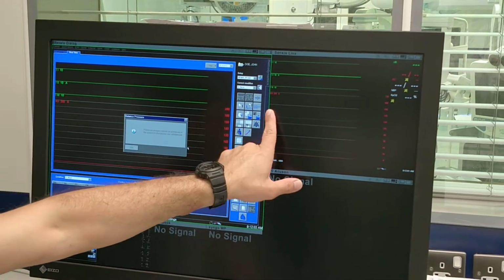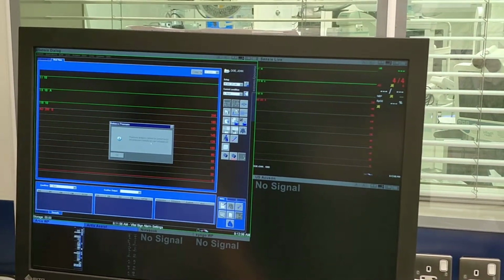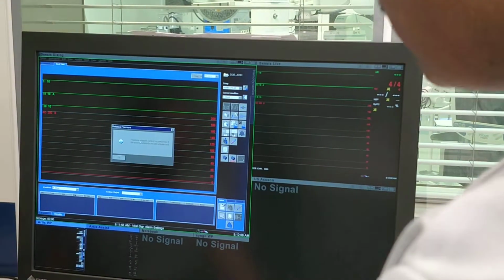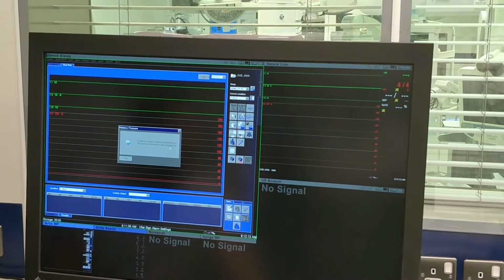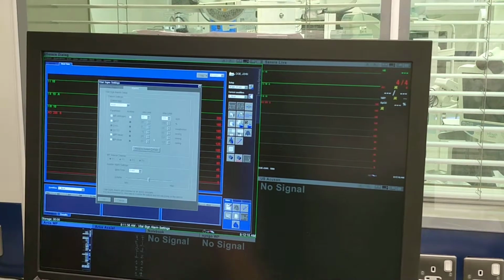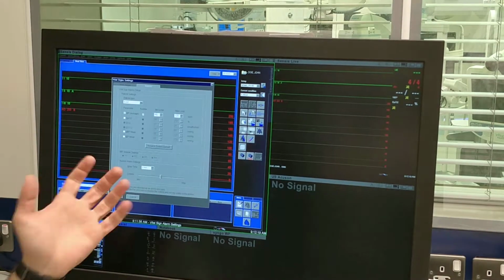So in post-processing here, see that tab, it is post-processing. Now, what does it say here? Pressure analysis cannot be performed if the pressure transducers are unbalanced. So that means, okay, so this is your alarms. The moment you close it, the alarms came.